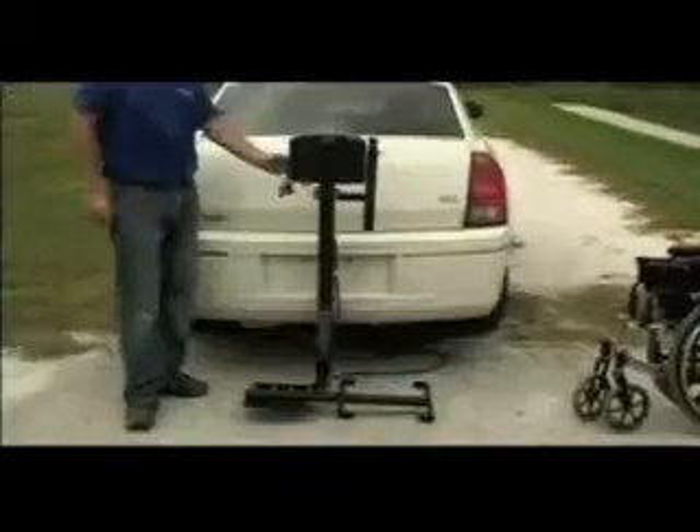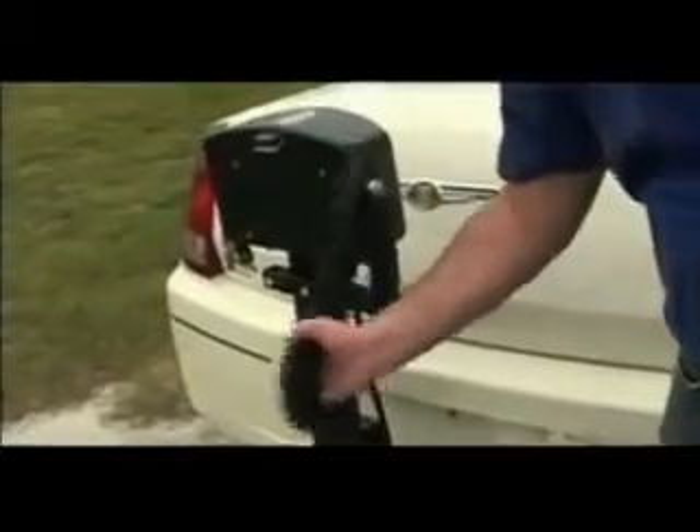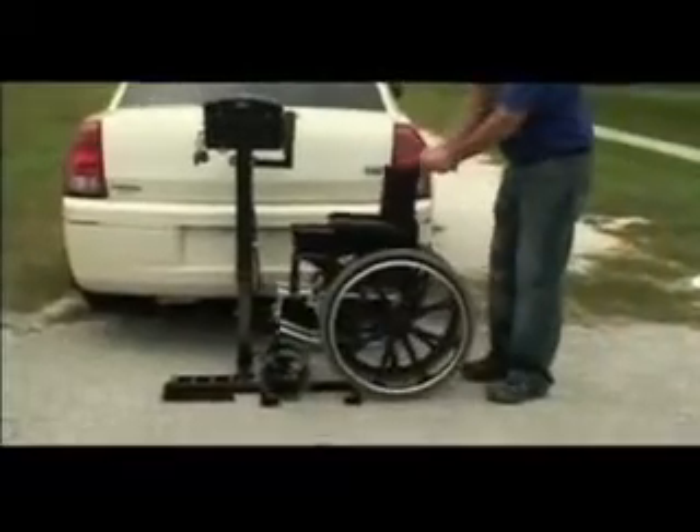Raise the lift and remove the box. Lower the platform to the ground. Raise the hold down arm. This hold down arm must be adjusted to secure the wheelchair to the lift.